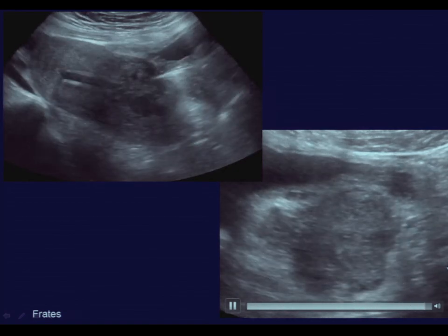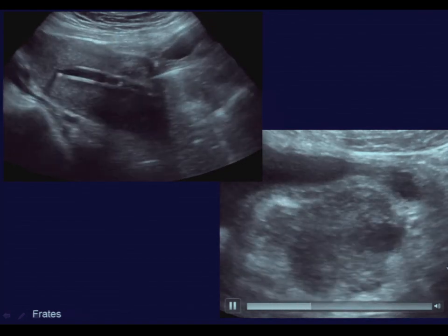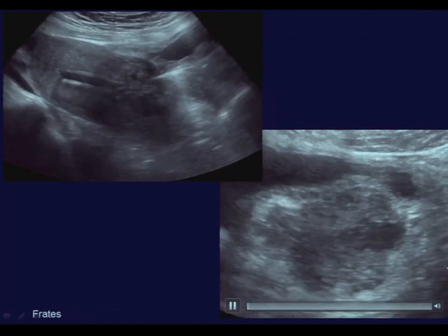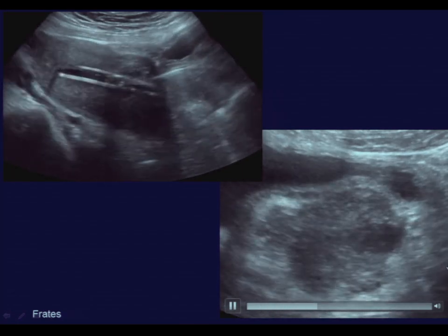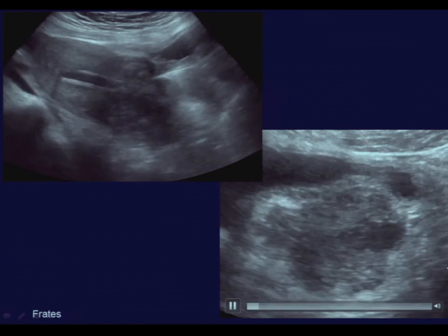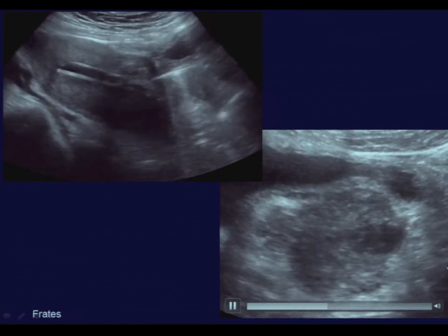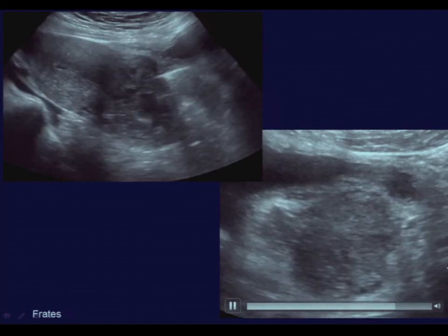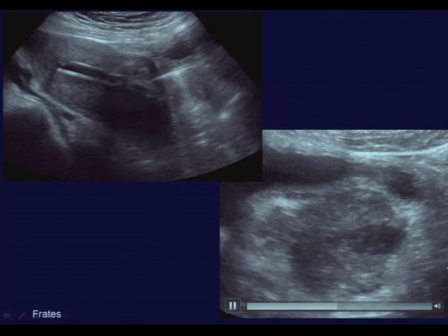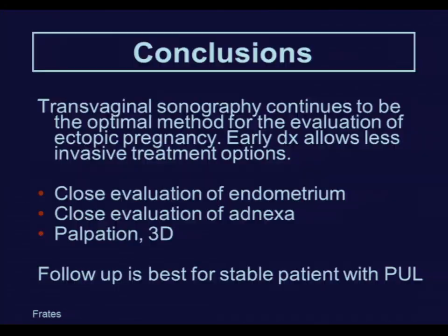So be very careful with implantations that appear to be in the region of the C-section scar or in the region of a cervical pregnancy. And intervention is not indicated until the diagnosis is clear, and then with ultrasound guidance, with uterine artery embolization, and high consideration to injecting with KCl or methotrexate these abnormally situated pregnancies because of the high risk of bleeding.